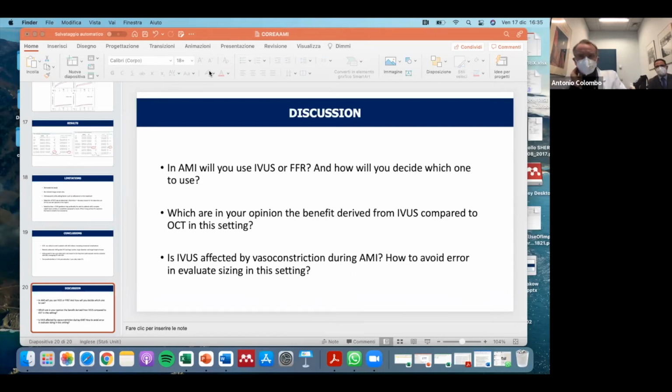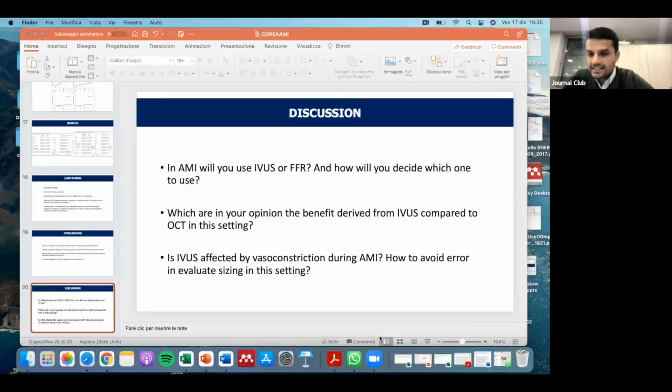Okay, thank you. There's a question on the chat, Prof, about intravascular imaging in an acute setting. We've already discussed a little bit about OCT, but specifically, if, for example, you see a little bit of haziness but no luminal narrowing on the diagnostic shots, some people would use OCT to see evidence of plaque rupture or thrombus.